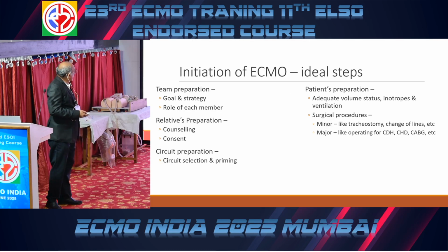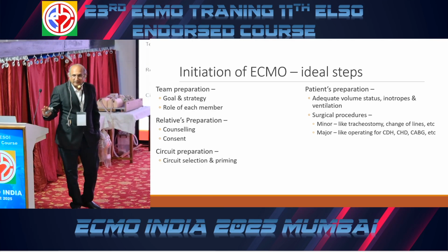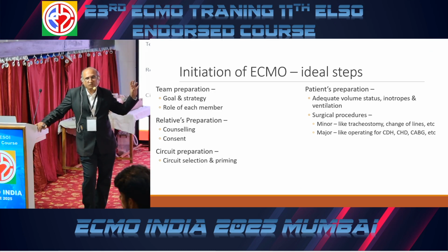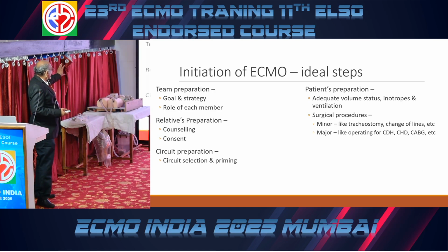No questions, then we'll go to the next: initiation and monitoring of ECMO. Now most of the things I already covered, so I'll just go fast. What I want is for you to see some videos so that it remains in your mind. So the initiation steps, as I told you: team preparation, relatives preparation, circuit preparation, patient preparation.